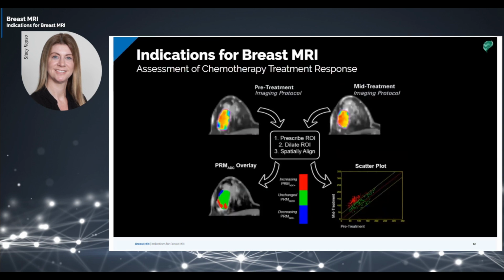Localized tissue markers are placed before the beginning of treatment to preserve the location of the tumor in the event of a complete response. In some cases, patients who have had partial or total mastectomy undergo an MRI scan to search for any residual extension in the remaining tissue or deep fascia, as well as reoccurrence of new lesions.